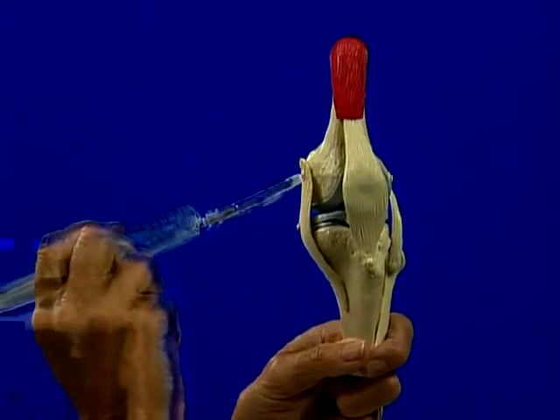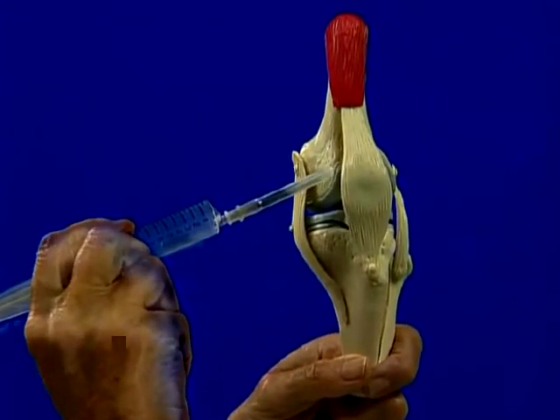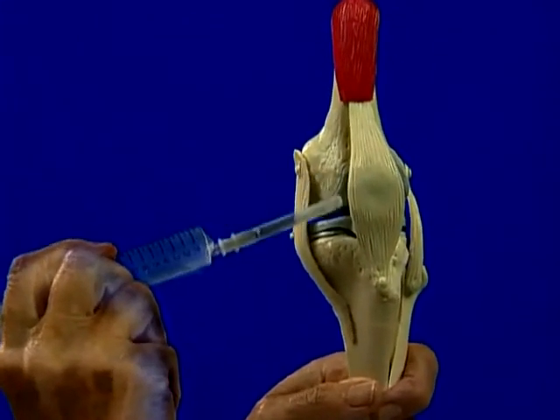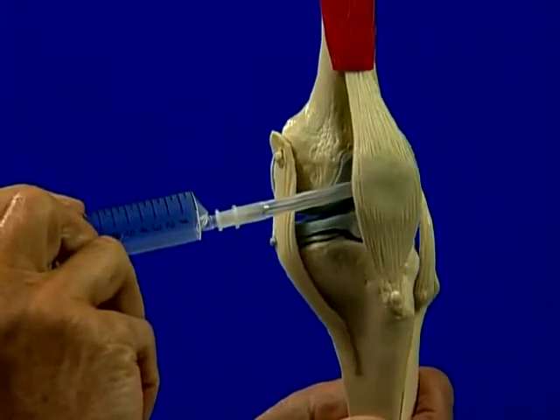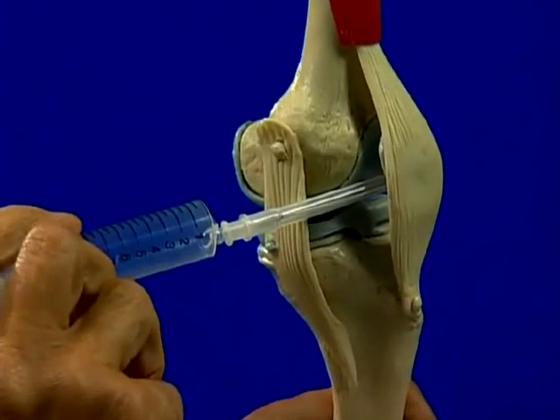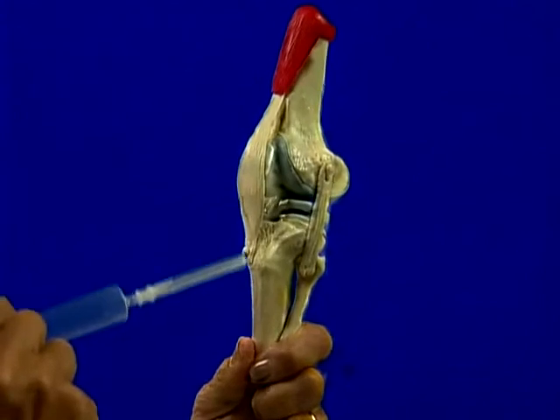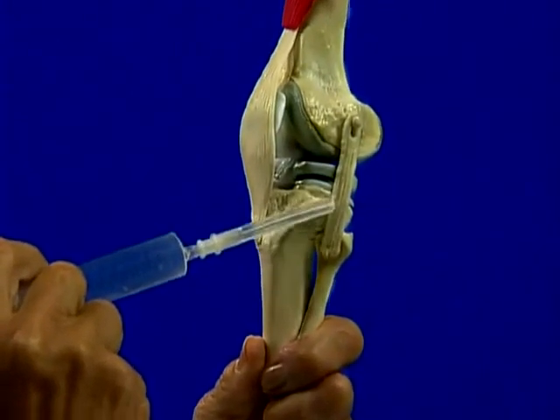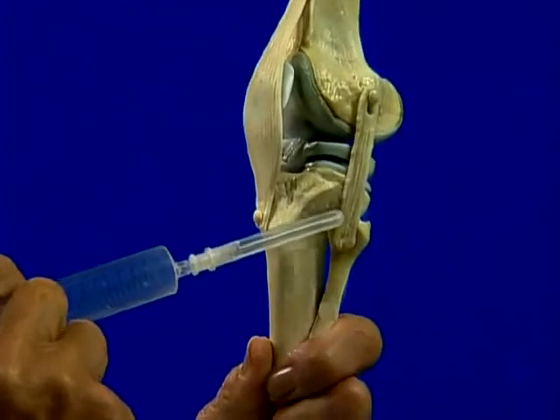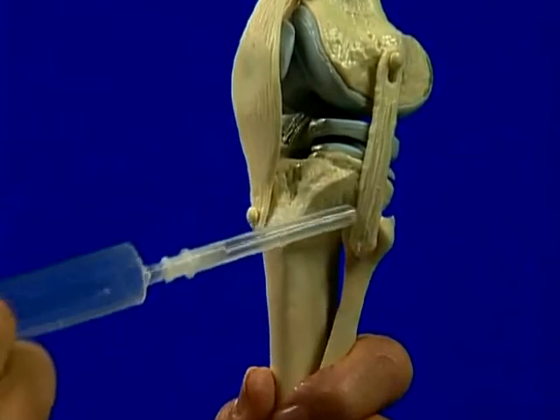Palpate the medial border of the patella. The needle is inserted and angles slightly upwards to enter the joint space behind the patella. Find the joint line which runs obliquely under the lateral shelf of the tibia. The injection is given by entering the joint space anteriorly and angling slightly upwards and laterally.